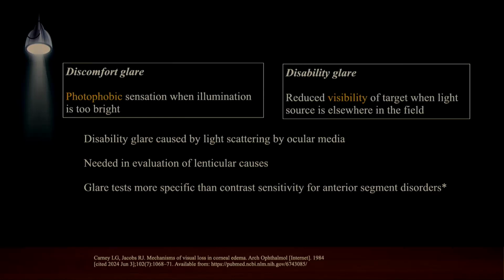And what did we do? We took a Philips 150 watt headlight and placed it in our refraction room. After the normal vision, we put that on. We took a simulated bright light vision and noted it. Then we took them to the bright sunlight of our hospital's terrace, and we used the Snellen's chart there the third time.